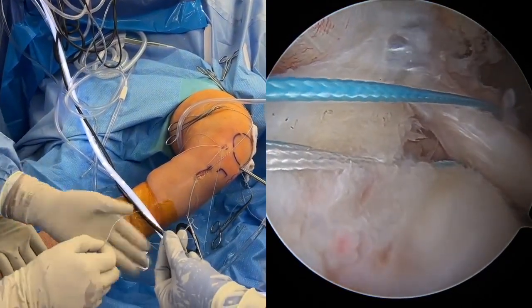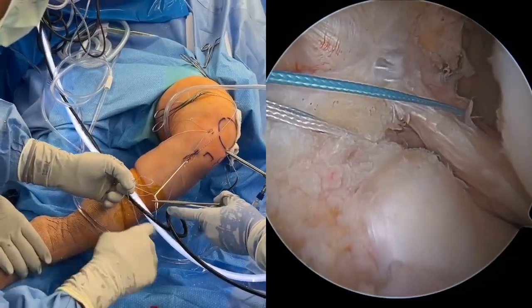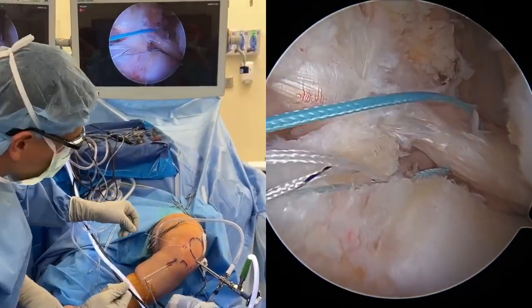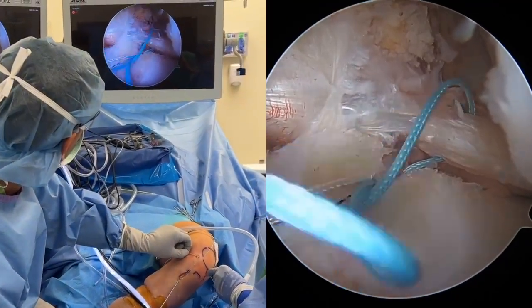The blue repair suture is loaded into the blue and white conversion suture loop and folded at the purple ink mark indicator. After removing the safety hemostat from the main anchor sheath, the repair conversion suture construct is shuttled through the trans-tibial tunnel by pulling the blue and white striped conversion suture tail at the distal end of the implant.